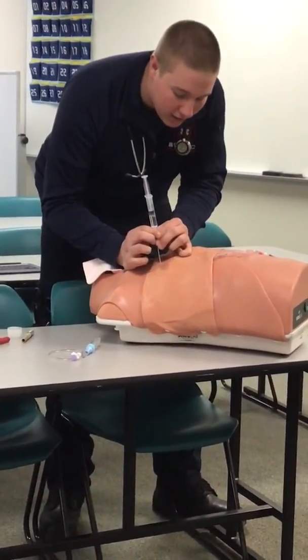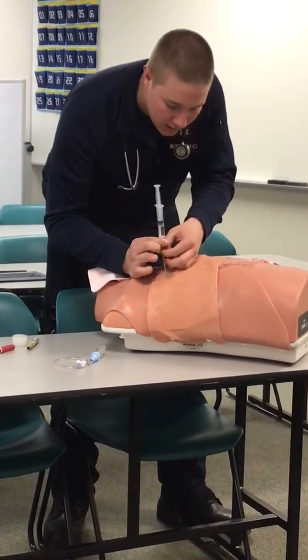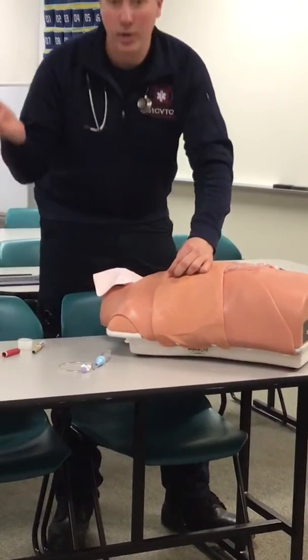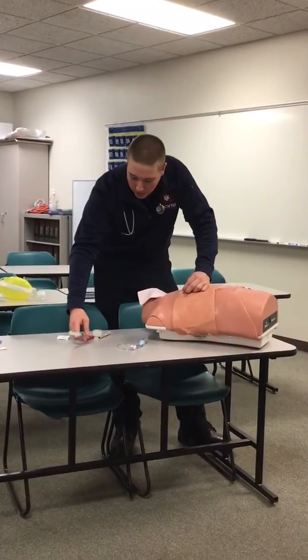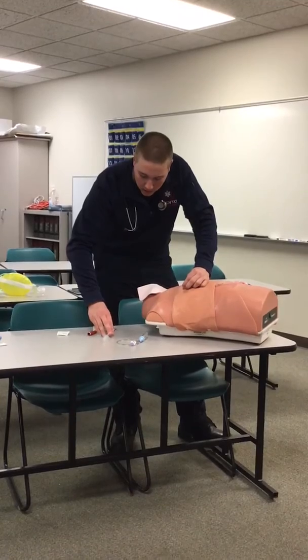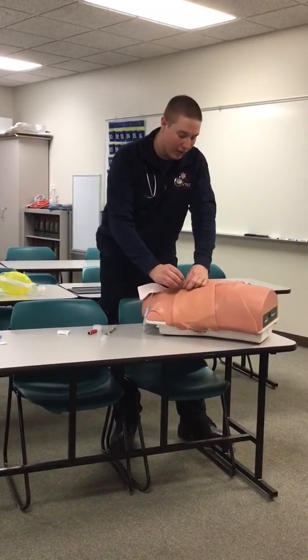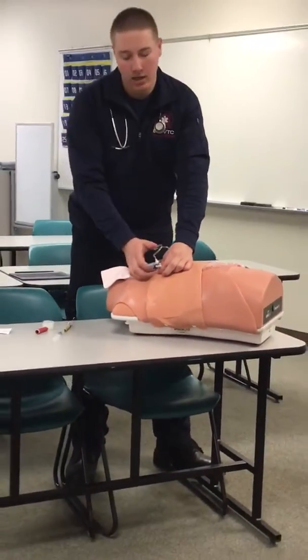So now that I know I'm in, I'm going to advance the catheter into the patient, and then I will remove the needle. I would sharps this, but due to this being a training needle, we want to save this, so I will stick this back in the container here. Next, I'm going to attach my Heimlich valve, or one-way valve. This will allow air to come out but not go back in.